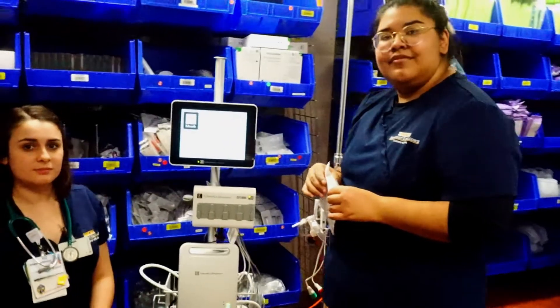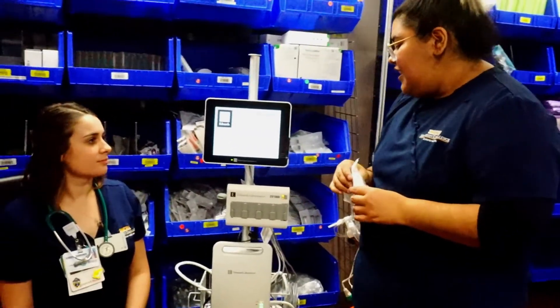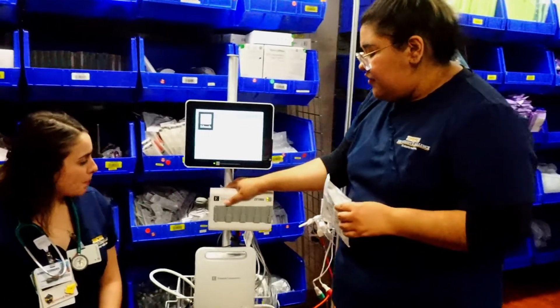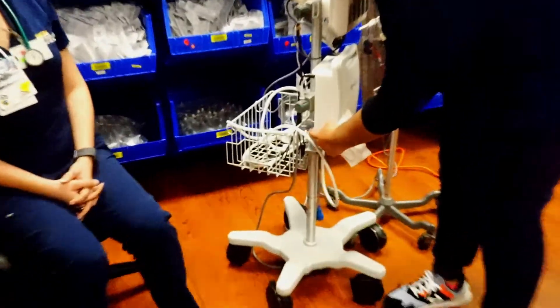These machines should stay plugged in when not in use. On the back you have the plug, so if it's not turning on for some reason, make sure it's plugged in — obviously it's not going to turn on if it isn't.